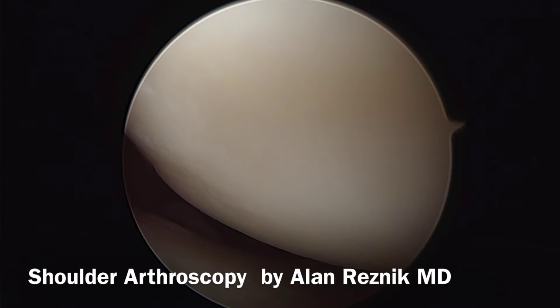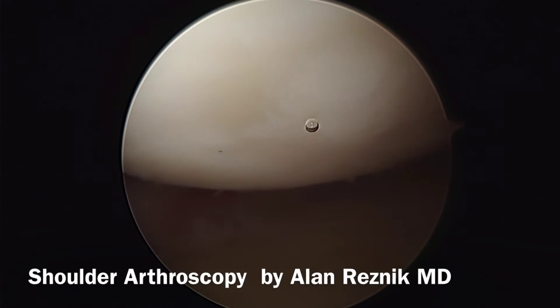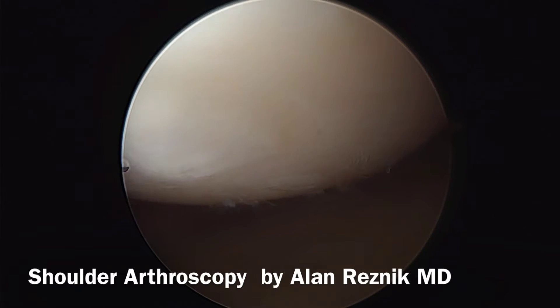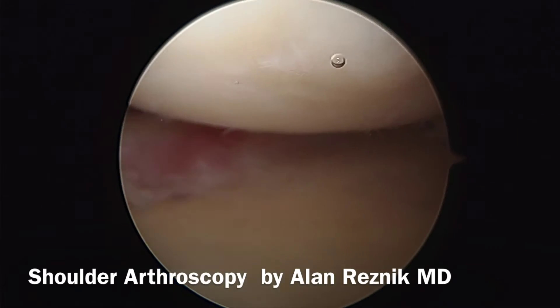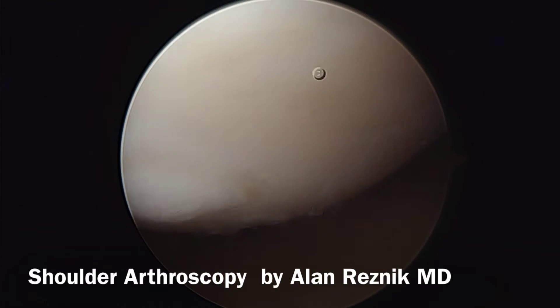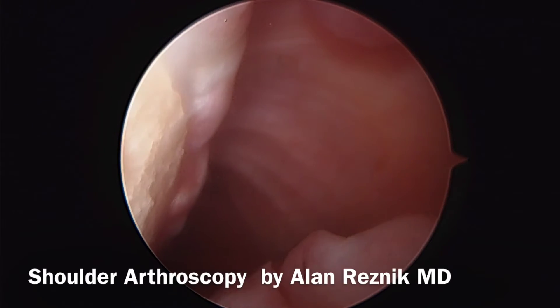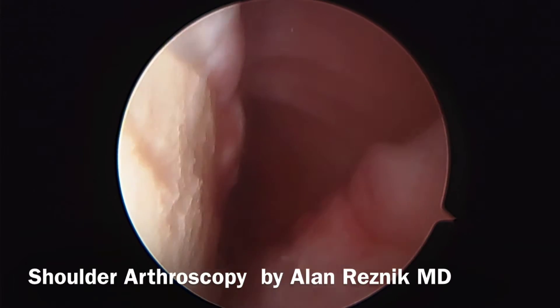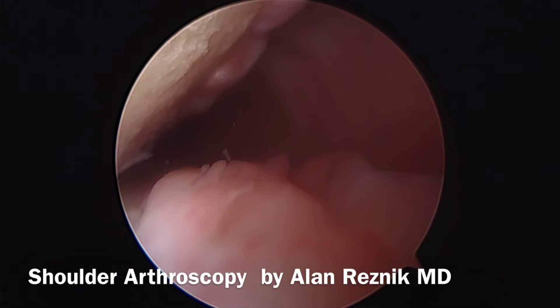This is a shoulder that has had a history of rotator cuff pathology for some time. This is the glenohumeral joint first — we're seeing the glenoid below and in the foreground the humeral head, which has a little bit of wear on it. This is the inferior recess. You can see the glenohumeral ligaments inferiorly and the capsule — a normal amount of capsule, but some inflammation on the inferior labrum.